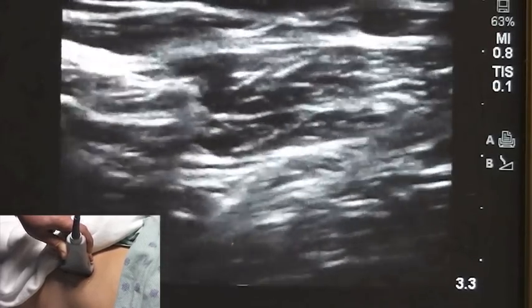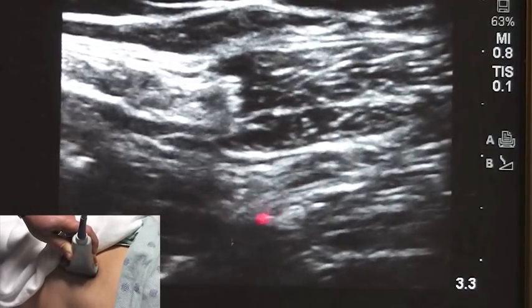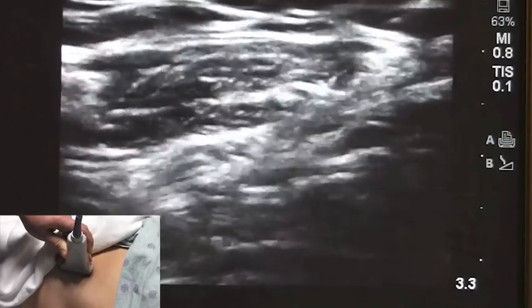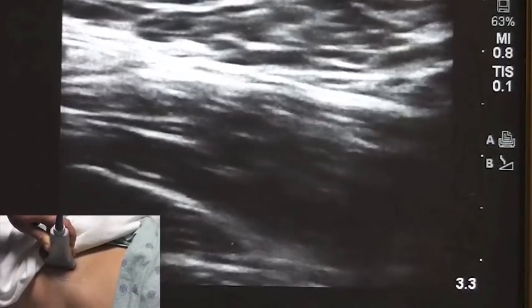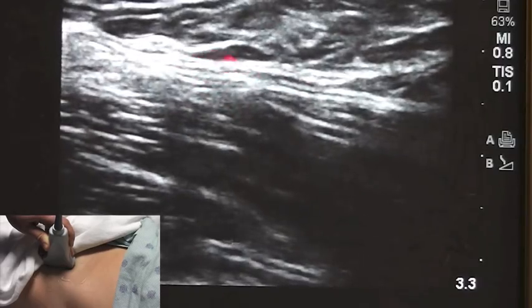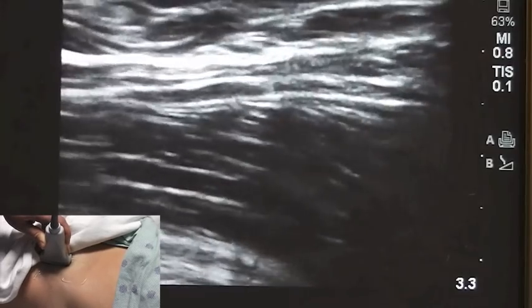As I move my probe upwards, you can clearly see the internal oblique muscle with peristalsis down on the bottom. As we move further down, you can see the transition point which is the inguinal ligament, as well as the sartorius muscle right over here.